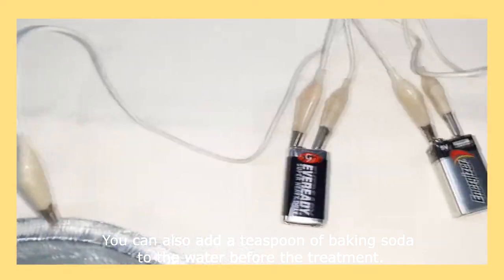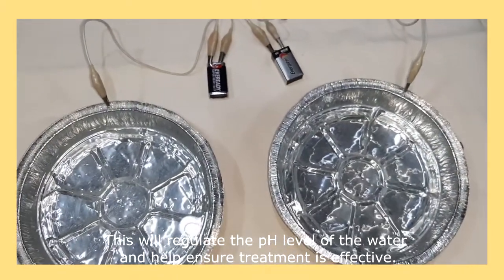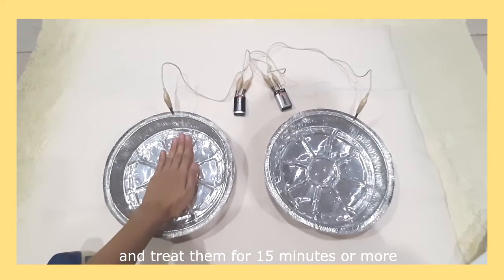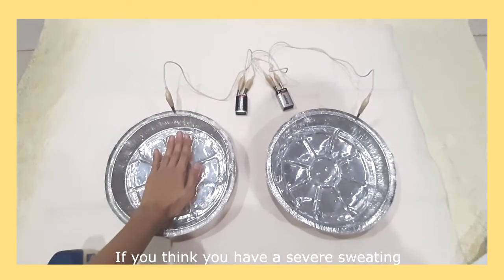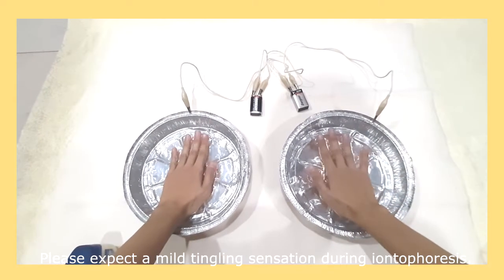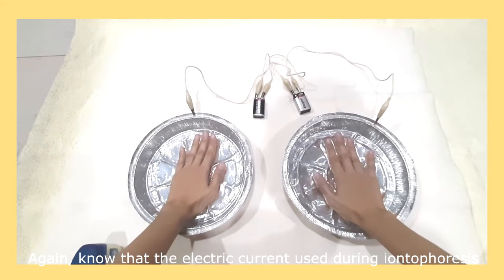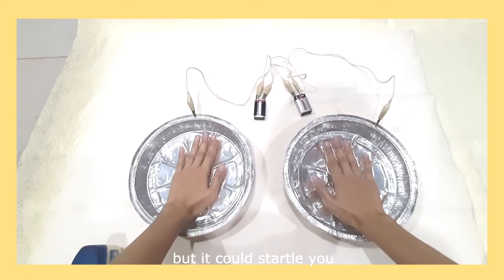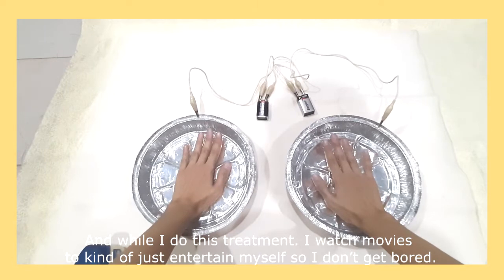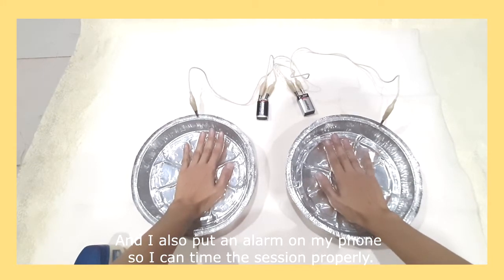You can also add a teaspoon of baking soda to the water before the treatment — this will regulate the pH level of the water and help ensure the treatment works as expected. Immerse your hands slowly, one at a time, and treat them for 15 minutes or more. If you have severe sweating, you can go for a longer treatment like 20 minutes. Please expect a mild tingling sensation during iontophoresis. The electric current used is not strong enough to cause a harmful shock, but it could startle you, so don't remove your hands from the water during treatment. I watch movies while doing this to entertain myself, and I set an alarm on my phone to time the session properly.